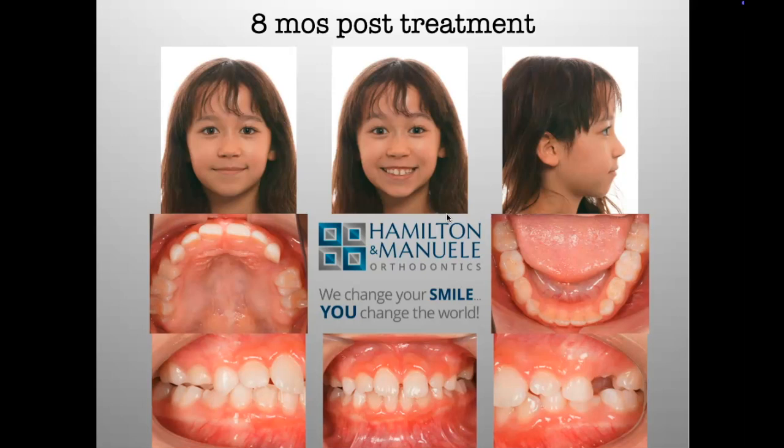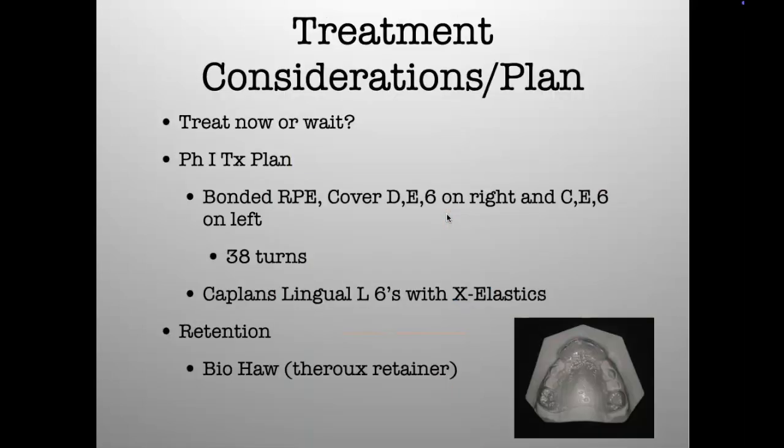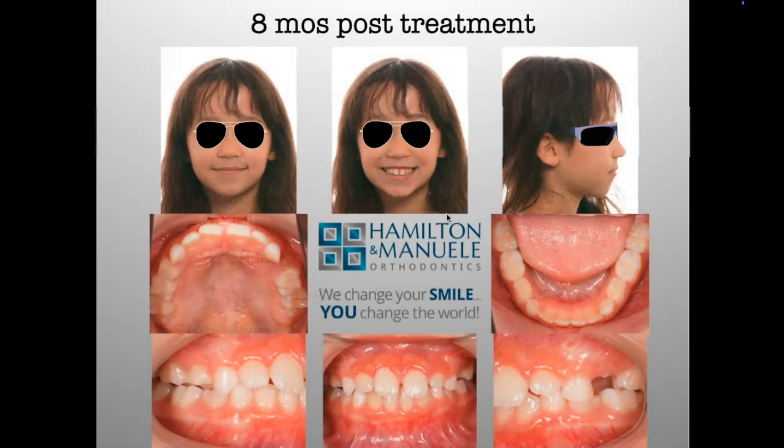We also ran some cross elastics on the lower sixes, right? When we're expanding 10 millimeters at the screw, the teeth and bones together are moving about 10 millimeters. Well, now neither side's going to fit unless you continue to upright those lower teeth over the bone. So that's what we did, and we took the expander off. This is 8 months post-treatment. The expander was on for about 4 months. You can see that the premolar is now erupting.